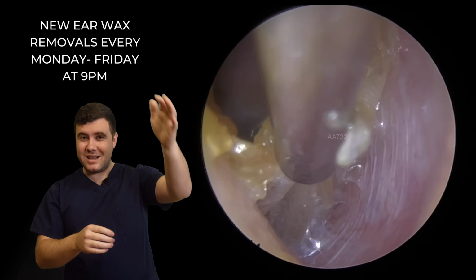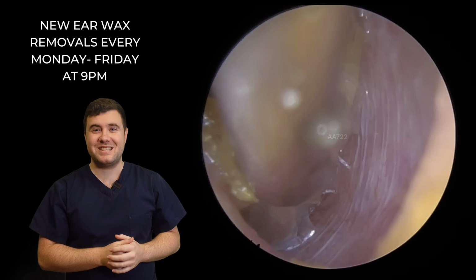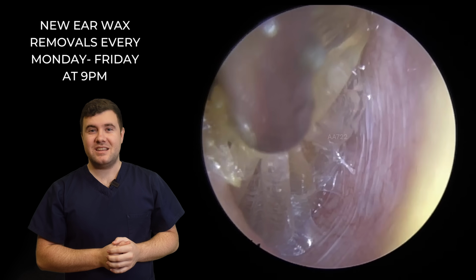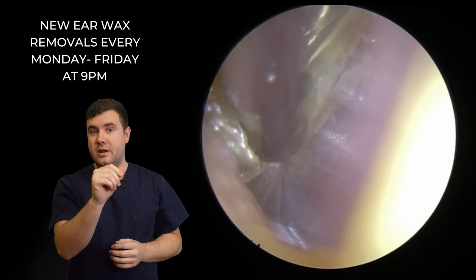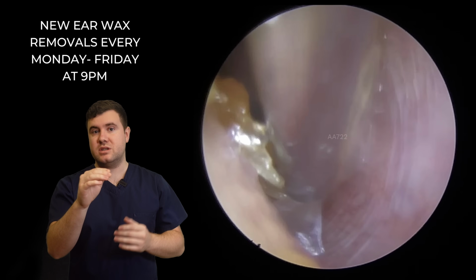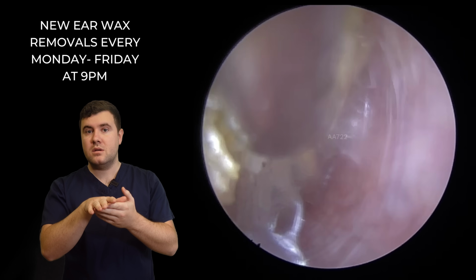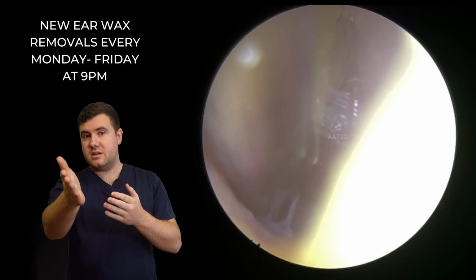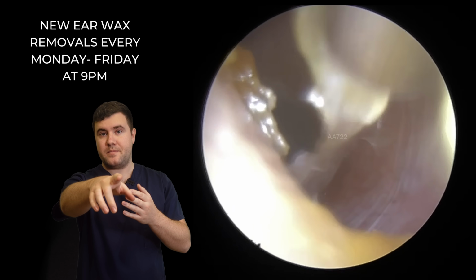Look at this all peeling away from up the side and up the top as well. It's coming away quite nice. So I'm hoping this is going to just tear away here now, because this is more than likely going to be still attached to some newer, fresher skin underneath at some point. Here you go, this has started to detach from the side there. You can just see it tearing away at the bottom.